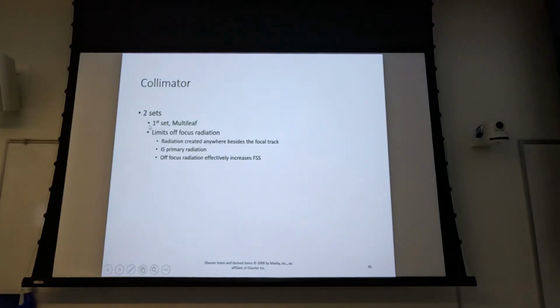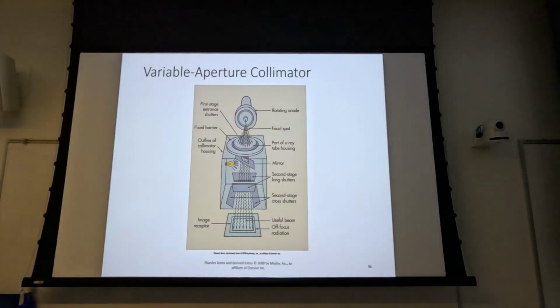We're talking about your collimators, truly your variable aperture diaphragms. If you look up inside the X-ray tube, you have two sets, and I'm not talking about some that fold in this way and some that come this way. Let's see if we've got the diagram in there. Yes. So what you have is this set down here, which is four shutters, the ones you're most familiar with.